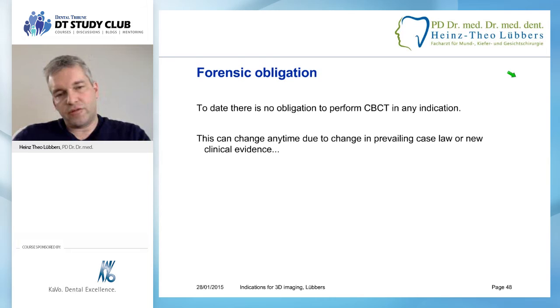And on the topic of forensic obligation, to date there is no obligation to perform CBCT in any indication, but I'm pretty sure this can change. Of course, anytime there's prevailing case law or new clinical evidence for some situation, but that's normal. In the medical area and in dentistry, you have to keep your eyes open and see if some treatment comes up which is the new gold standard, and then you want to change your old mind, moving to the new treatment concept.